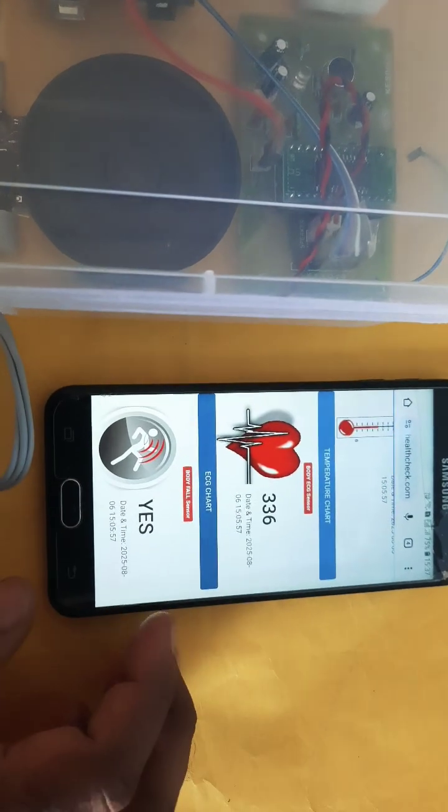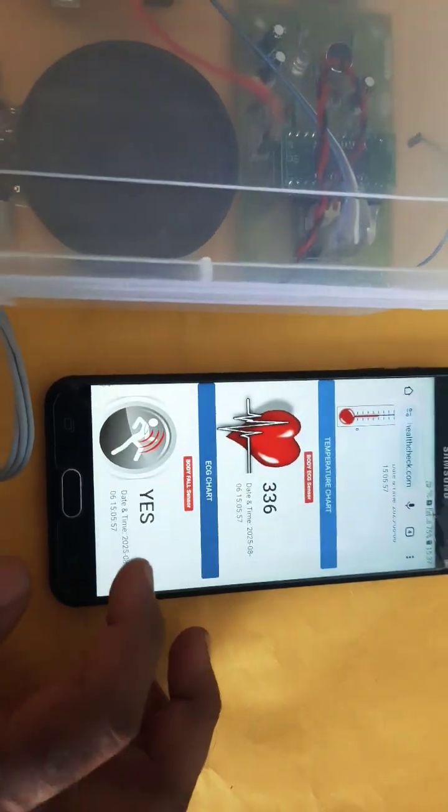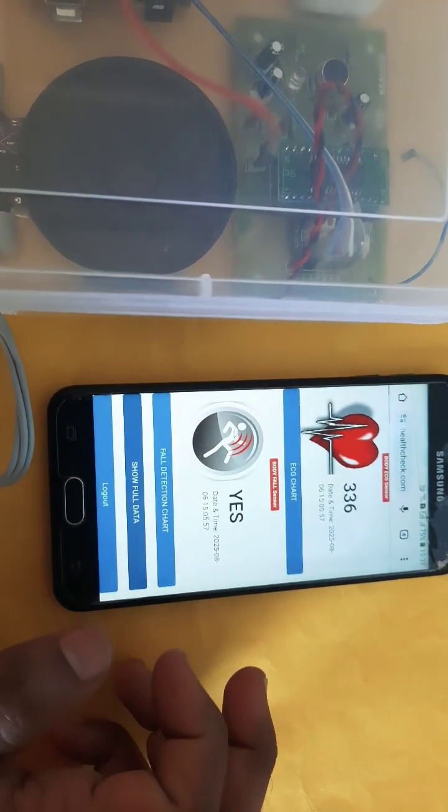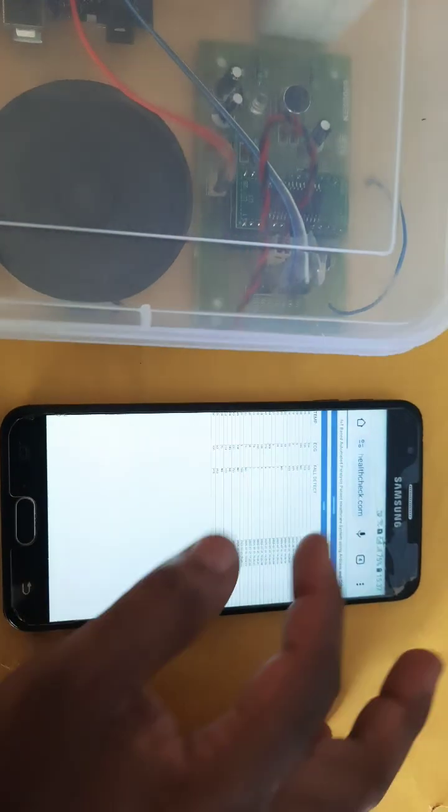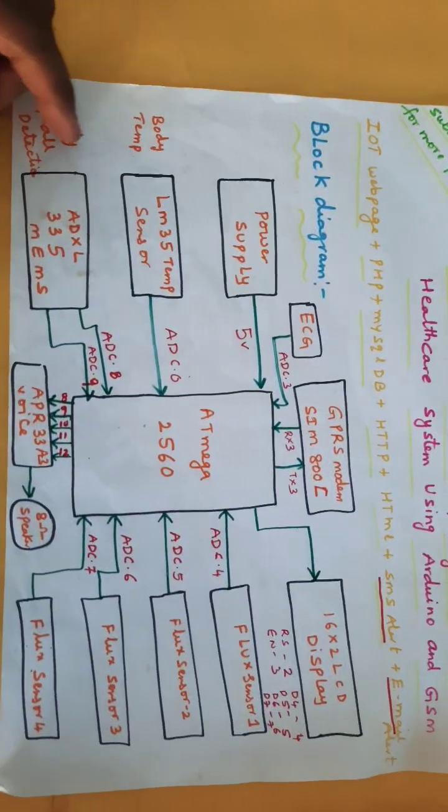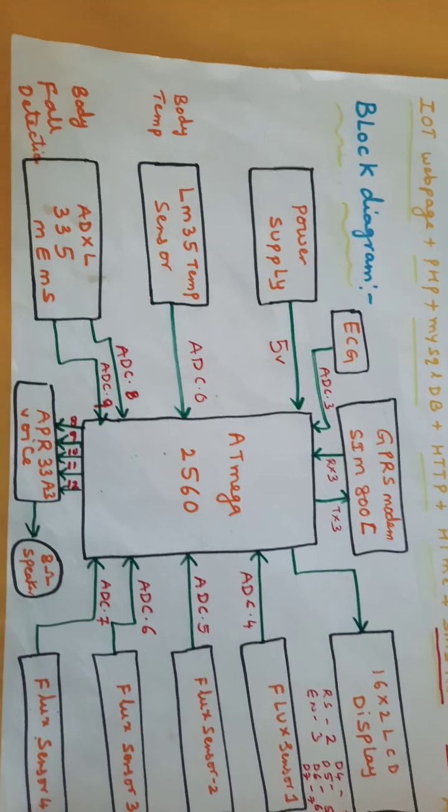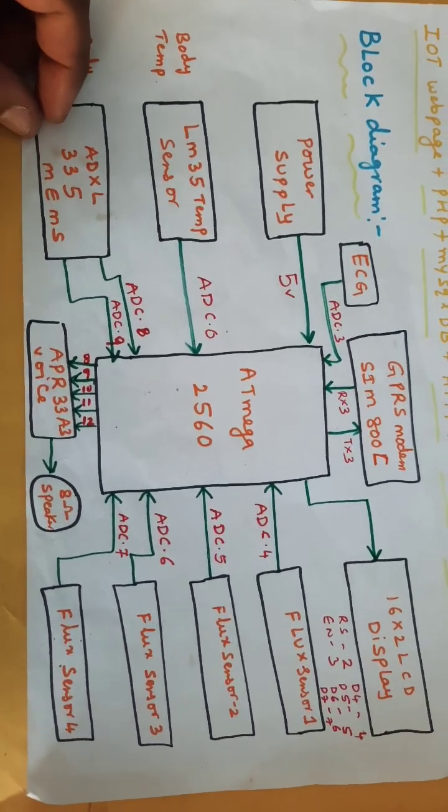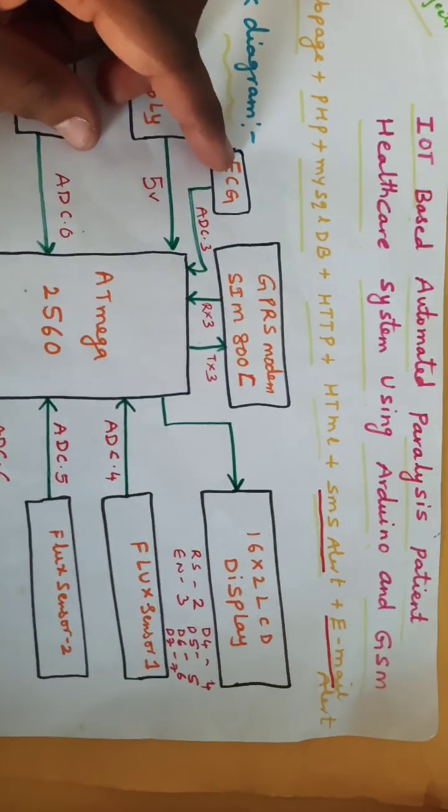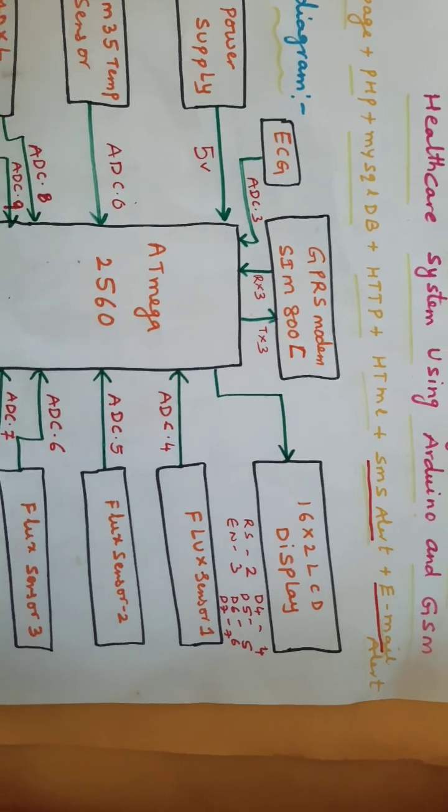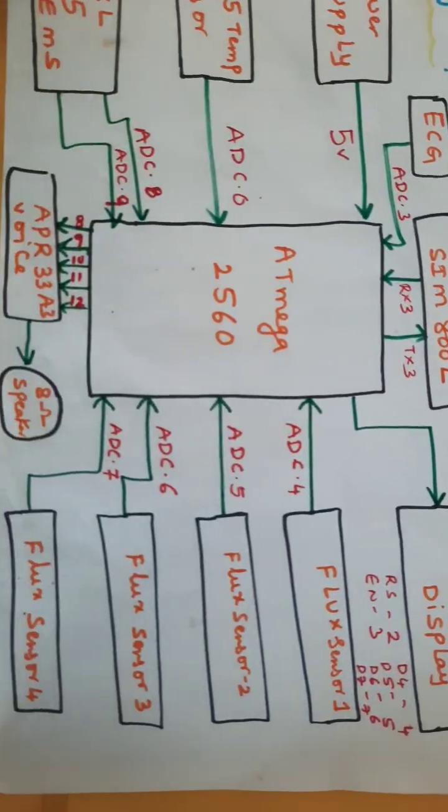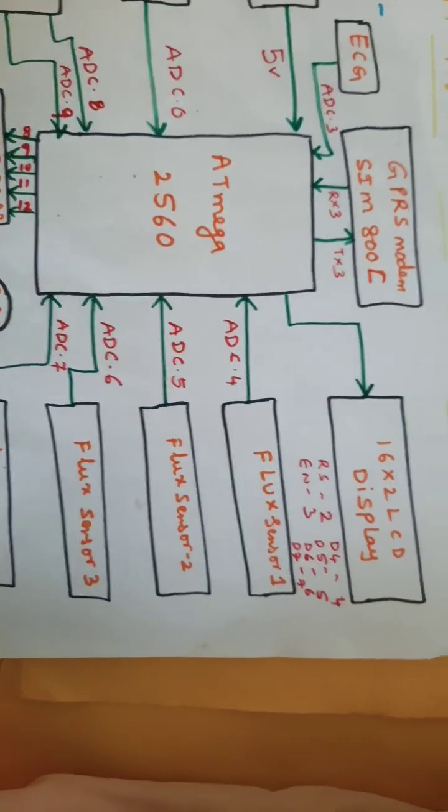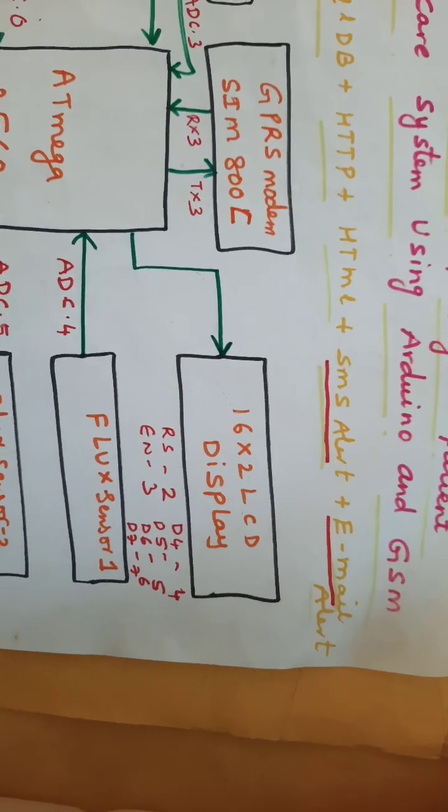The components include power supply, Arduino Mega 2560, LM35 temperature sensor, ADXL 335 fall detection sensor, ECG module, GPRS modem with RX and TX, and APR33A3 voice recorder and playback module.